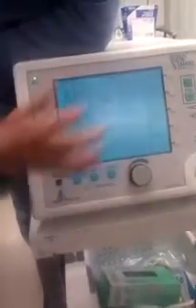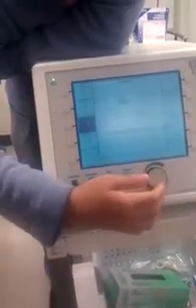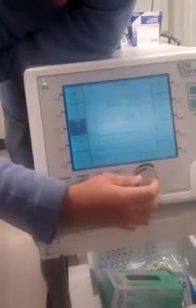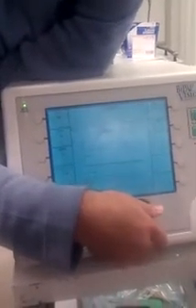Let me bump up this rate. Why can't you just breathe? What's that rate on? I'll just give you guys a for instance here. 15. Now watch 0.5. There should be a little difference here. But, again, it's a dummy. You probably wouldn't feel it anyway on him.